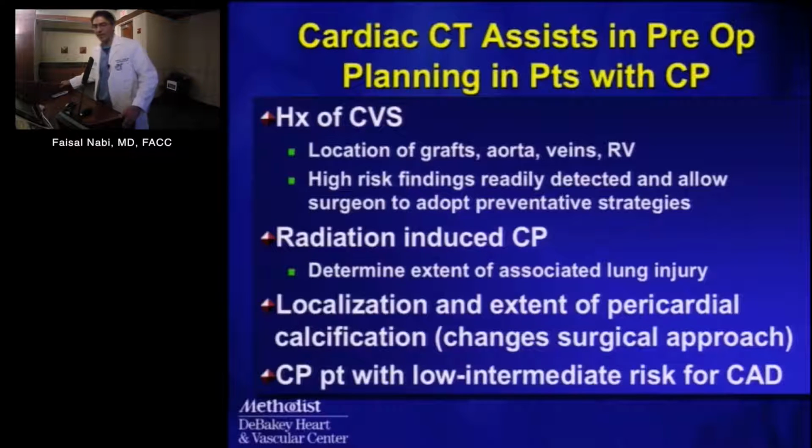But really CT's role, I think, is in those who are headed to the operating room, where you really need to know anatomy, those heading to the operating room with prior sternotomy, where you may have to know where vein grafts are, where the right ventricle is in relation to the sternum, where the LIMA is running. These are very important. It may also be in cases where the patient has injury from radiation, because as you know, radiation is a pan-cardiomyopathy and pan injury to all the heart muscle. It can involve valves, the muscle, the chest, the lungs. So you may need a technique that sees everything.